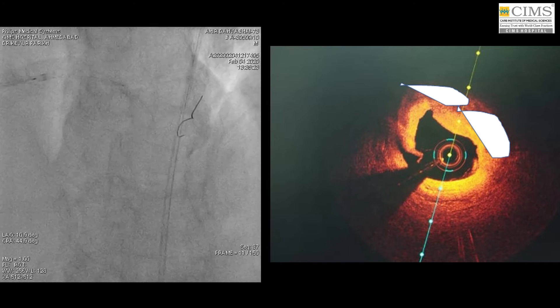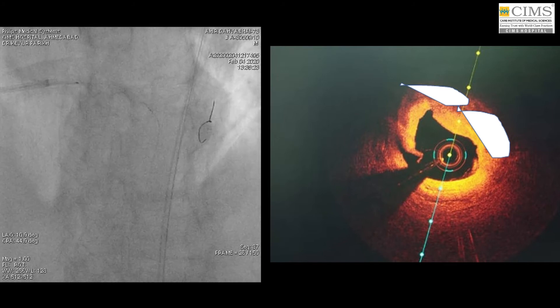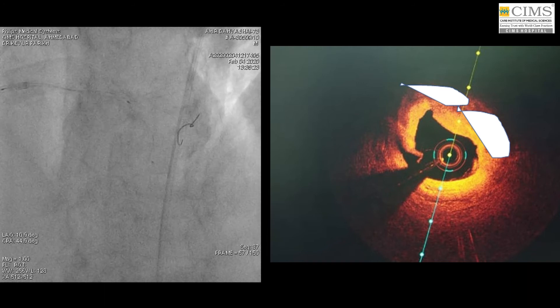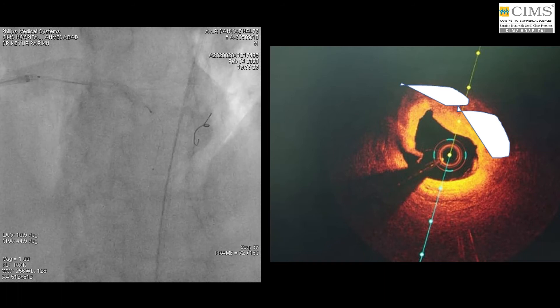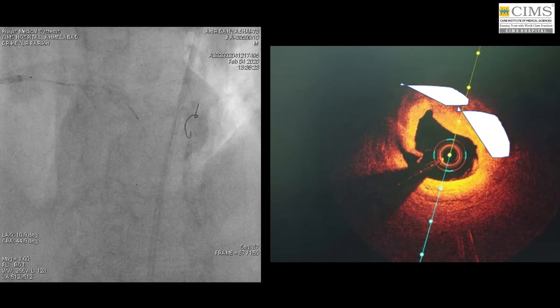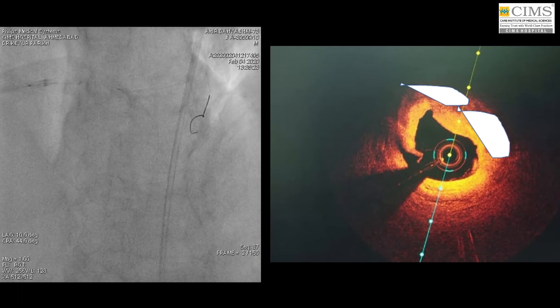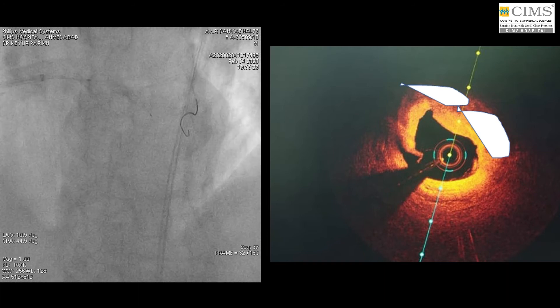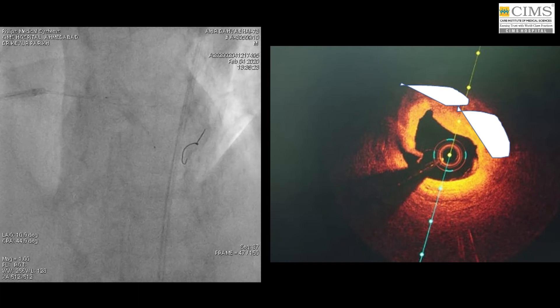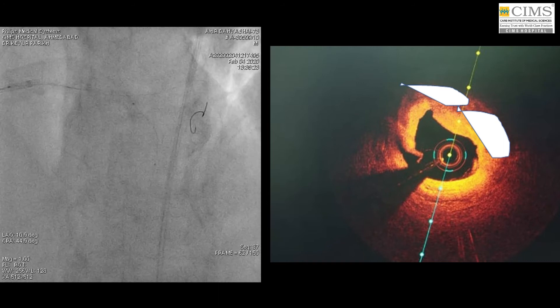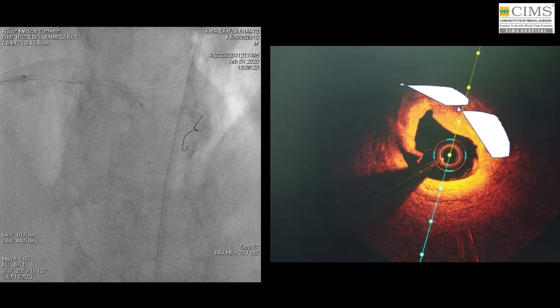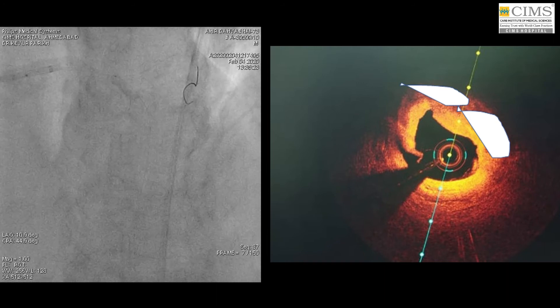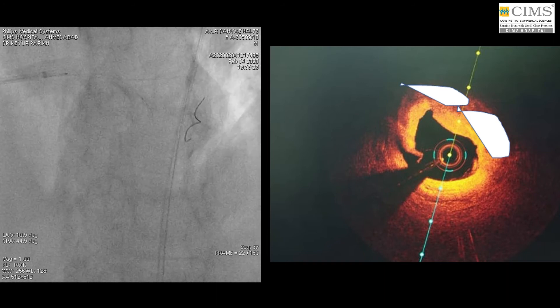On the right side of the image you can see the frozen OCT image. With the white marker at about the 11 o'clock to 3 o'clock position, you can see that this signifies calcium. You can see the amount of calcium in the lesion, and at about the 7 o'clock position there is a dissection produced by the balloon dilations which were done in the artery.